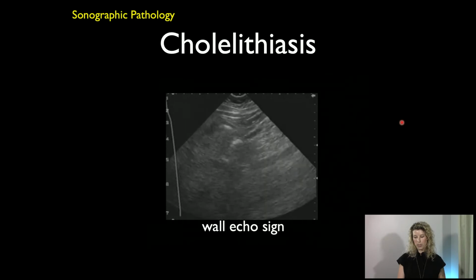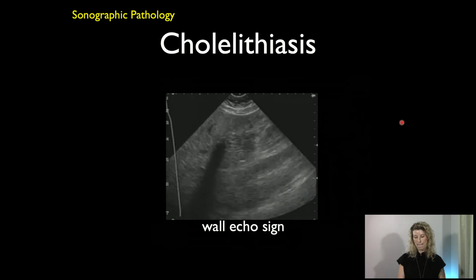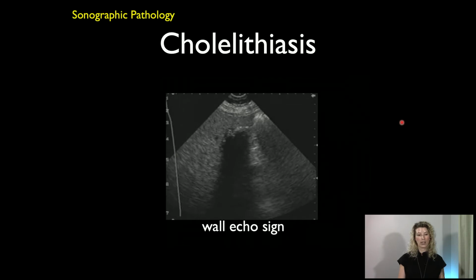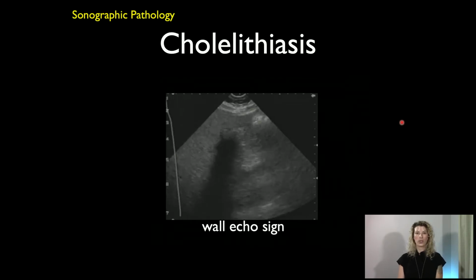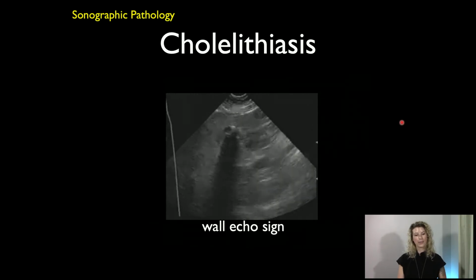And just one more clip of this. Right, you can't even see the structure of the gallbladder. It's so full of gallstones. And you wouldn't know this just by looking at it. I know this because this is a clip I know, and I know that it's full of gallstones.